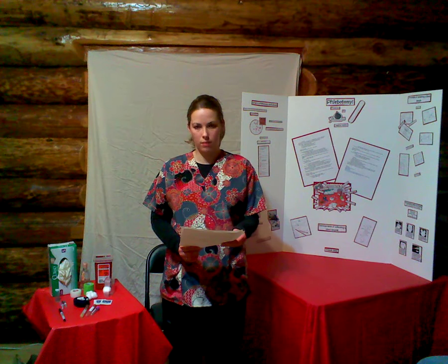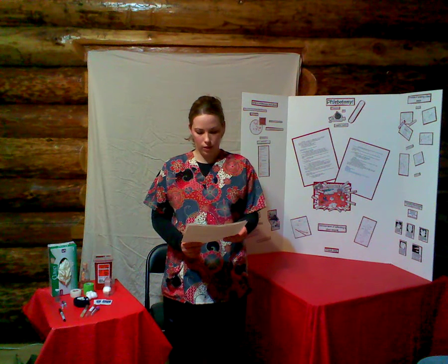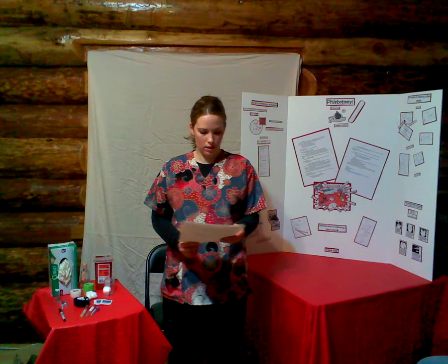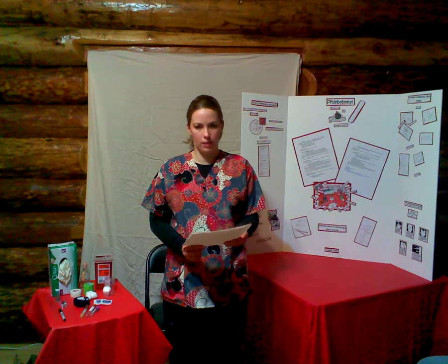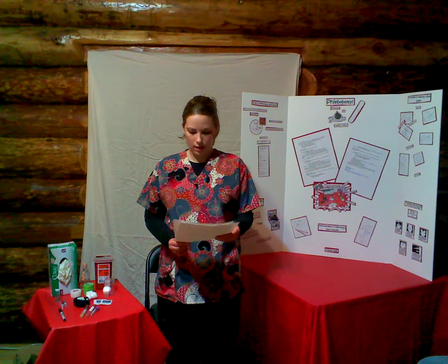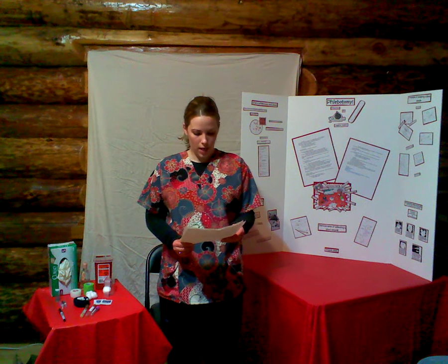I'll briefly discuss the process of obtaining a blood sample. Prepare supplies and area. Use all safety measures. Properly identify the patient. Skillfully obtain the blood sample. Collect enough for required tests. Collect in the correct tubes and label the collection tubes.